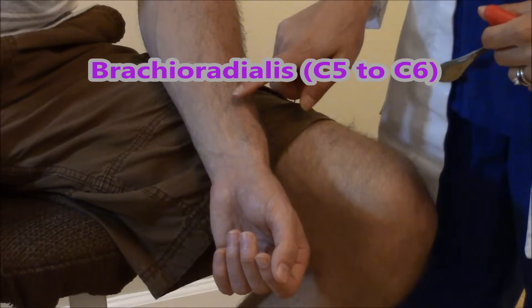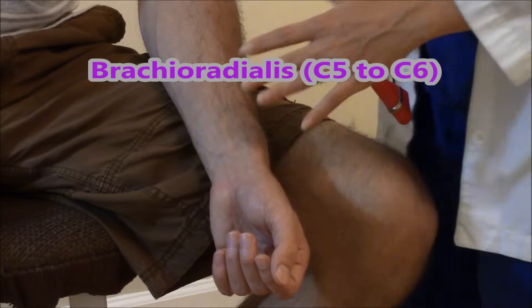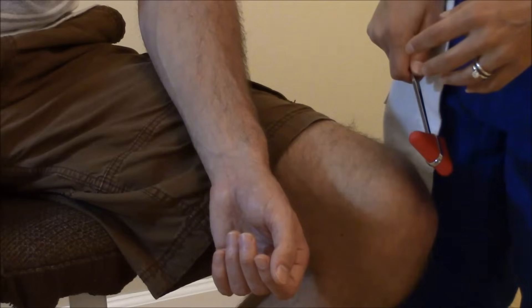We're going to check the Brachioradialis Deep Tendon Reflex, and this is checking C5 to C6. This can be one of the most difficult tendons to find because it's not as pronounced as the other tendons.